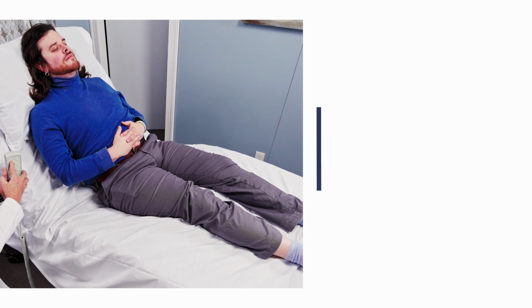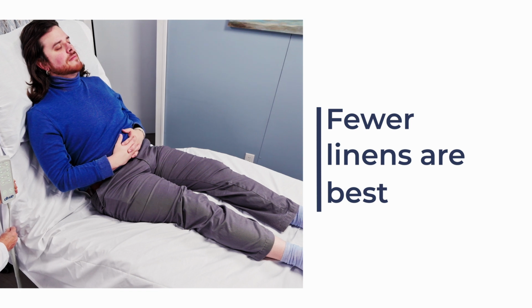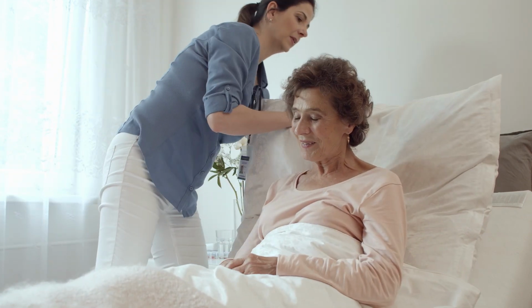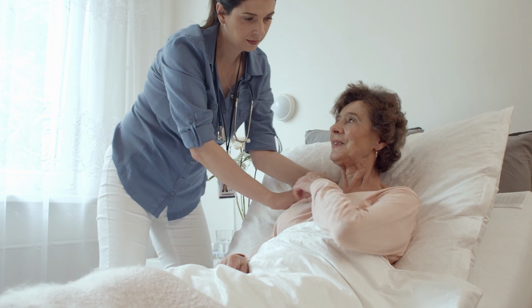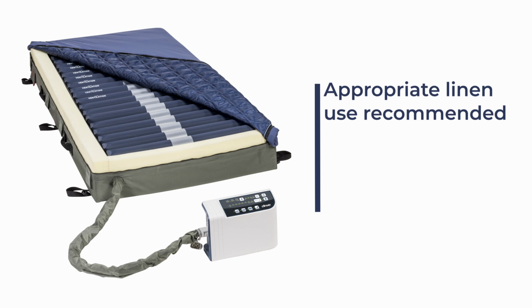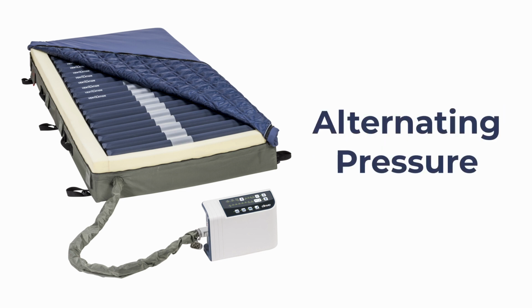Best practice dictates the fewer linens, and linens that do not block airflow or moisture vapor permeability of covers, like those we use on our PreserveTech MedAire Edge mattress, are best. However, DeVilbiss knows adult briefs and incontinence pads, if regularly changed and not full of wrinkles, enable caregivers to help control incontinence and maintain patient hygiene. So their use is not contraindicated on our PreserveTech MedAire Edge system, because even if low air loss is blocked by plastic or rubber, the patient can still get the benefits of pressure redistribution via the alternation provided by the PreserveTech MedAire Edge.